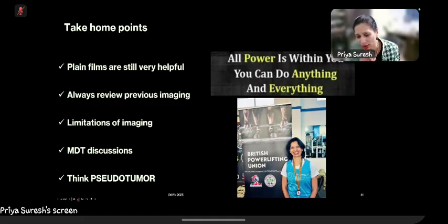Okay, MDT discussions are very helpful, and I especially, like I said, we learn a lot. A microbiologist also attends that meeting, and it's like a proper MDT approach to try and treat these. And yeah, please do think about pseudotumor, think about osteolysis, think about the T1. T1 is your friend. T1 sequences. So please use all those tools that you have, and don't forget plain films, plain films, plain films, plain films.